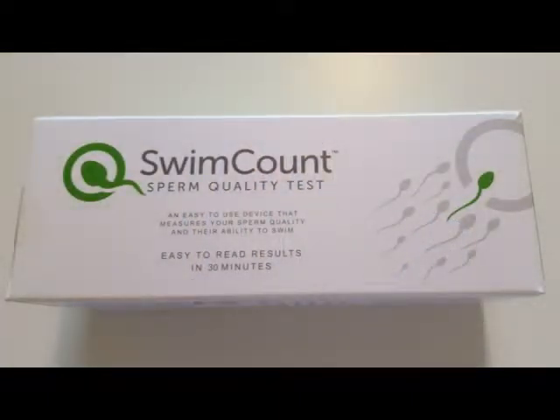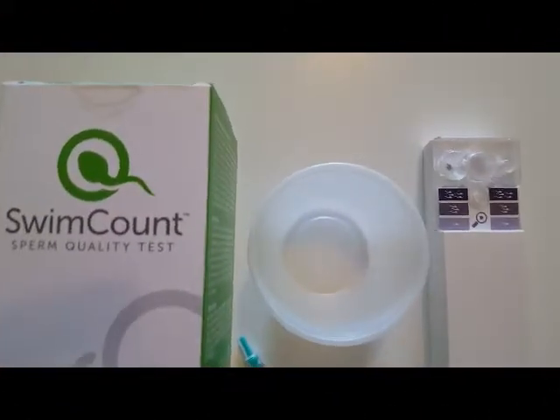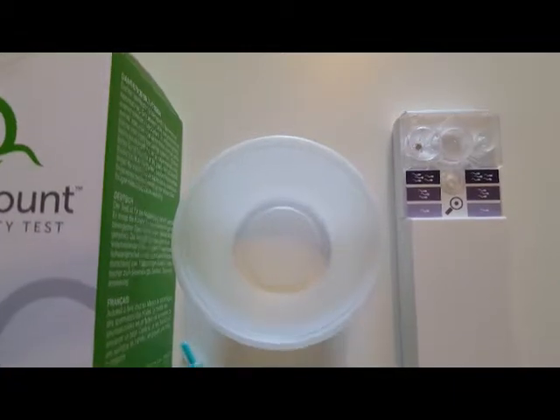So now let's take a look at the product. Inside the box you'll find detailed instructions on how to carry out the test, a sample cup, a syringe, and the test device.